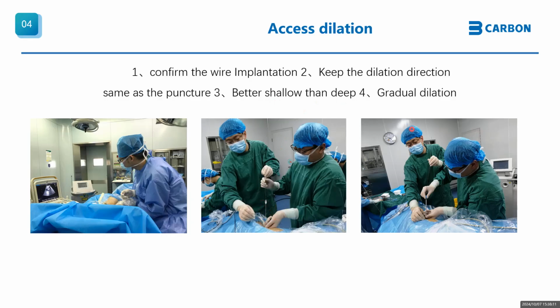Okay, the gradual dilation. It's safer for beginners. The gradual dilation goes from the small size to the larger size, gradual dilation.